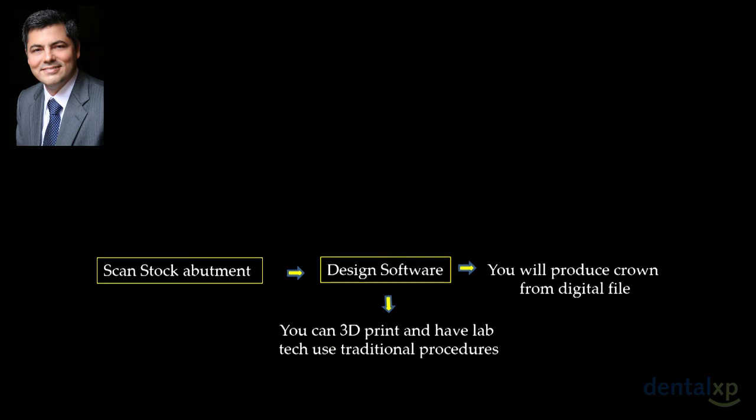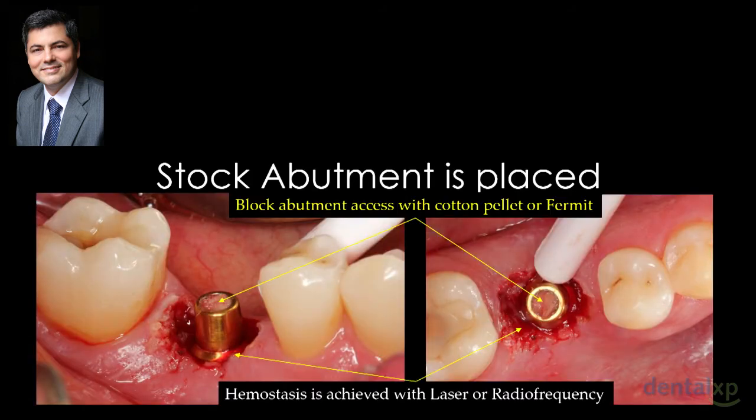The second option that we mentioned was scan and stock abutment, send the information to a design software to produce either a crown or to print. And this is how we did it. Same patient.